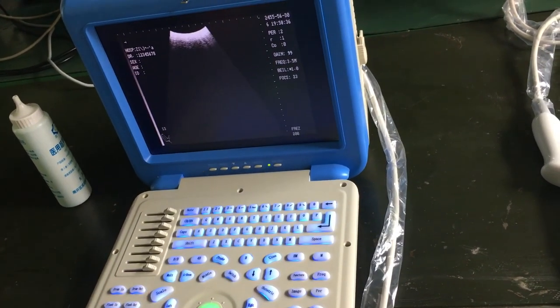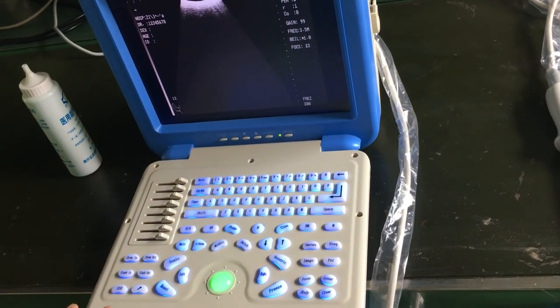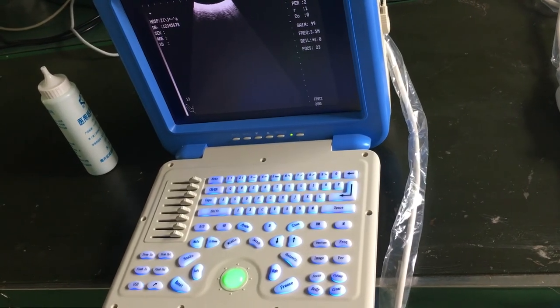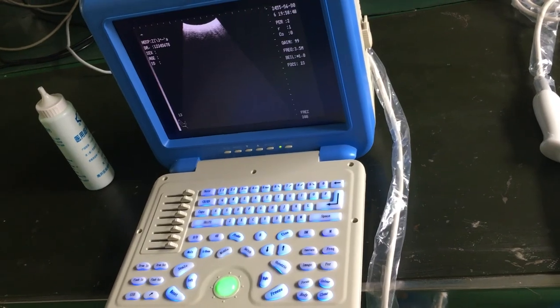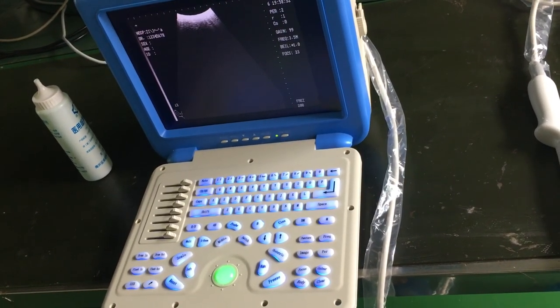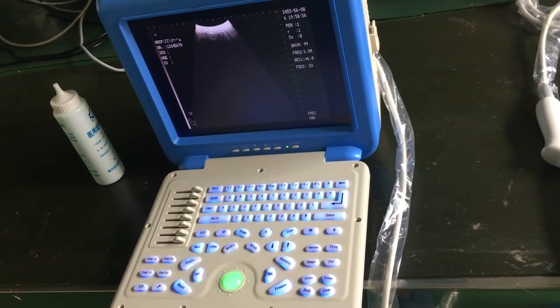Our machine supports the English language, so it is very easy to operate. If you want to buy an ultrasound machine, welcome to choose this one. We will provide 18 months warranty for the machine and 12 months for the probe. Thank you.